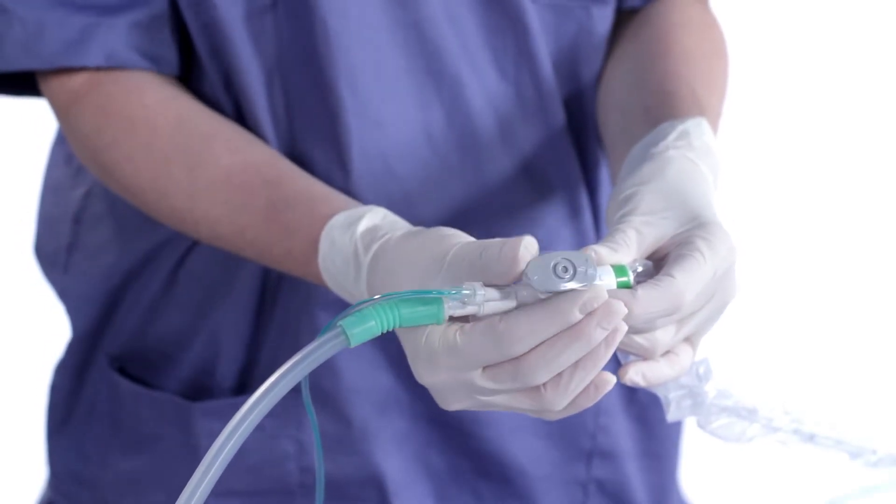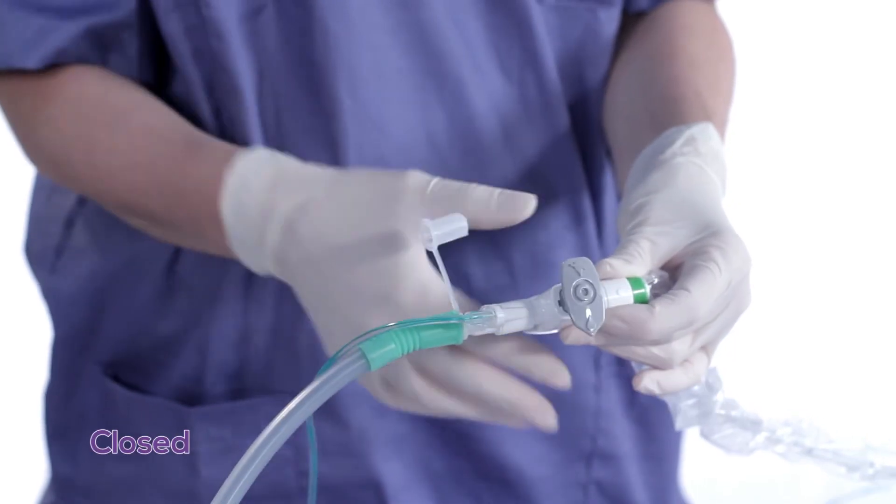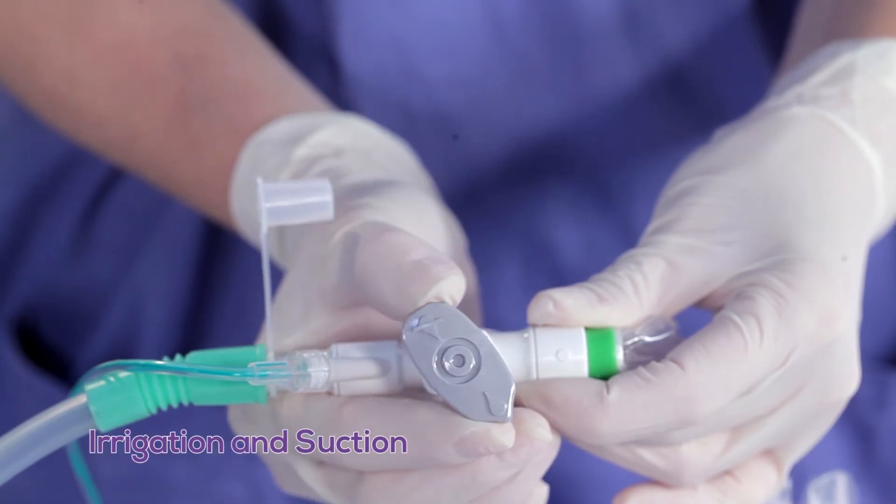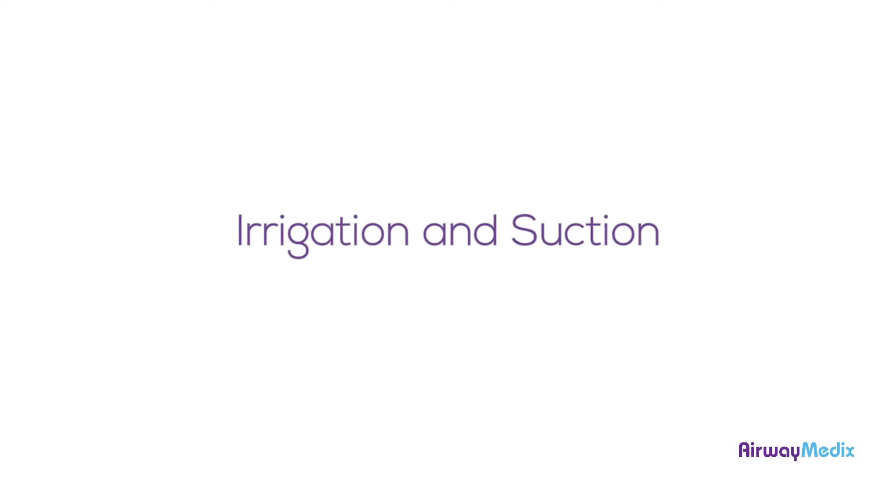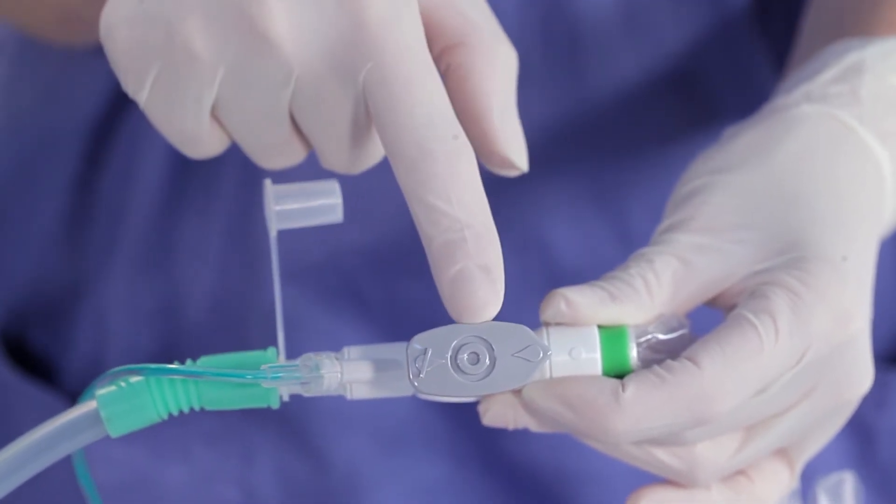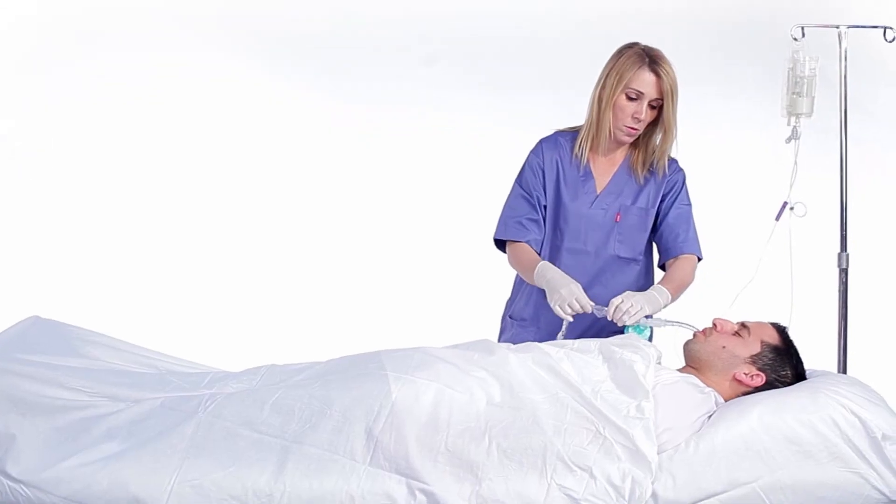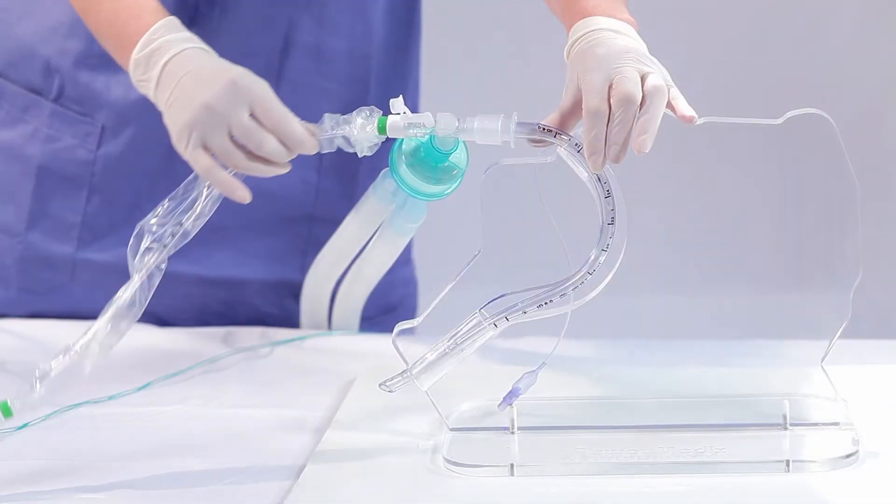To activate the closed suction system, set the Airway Medics using the thumb control valve, which has three settings: suction only, closed, and irrigation and suction. To use irrigation and suction simultaneously, turn the thumb control valve to the on position.